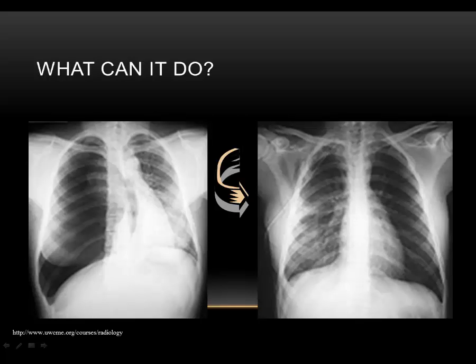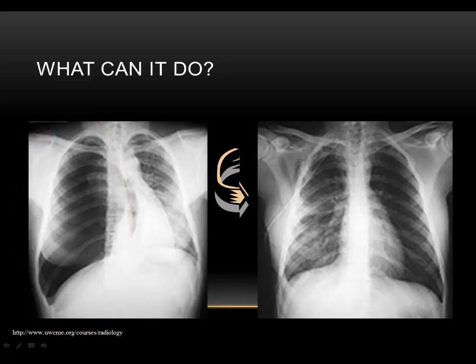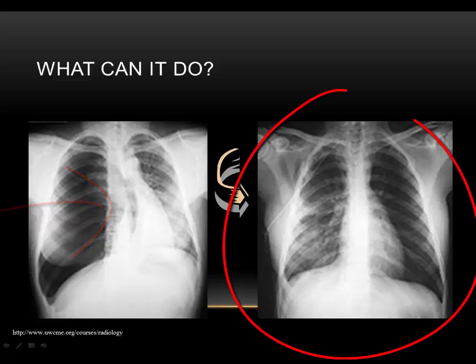These pictures show what a chest tube can do. The picture on the left has a patient with a right tension pneumothorax. You can see it pushing the lungs and the heart to the left side of the patient. The picture on the right shows the tension pneumothorax has been relieved.